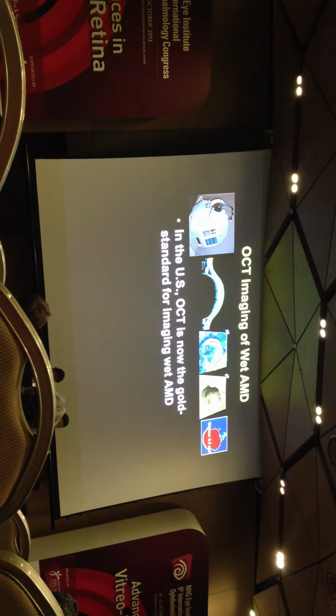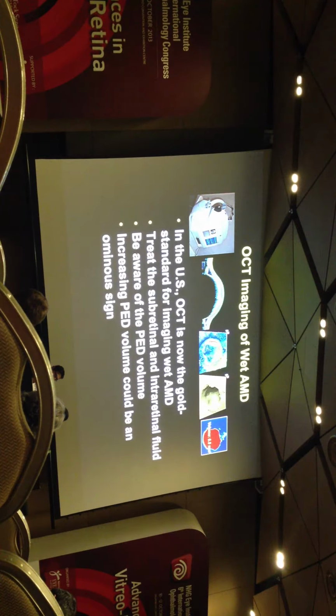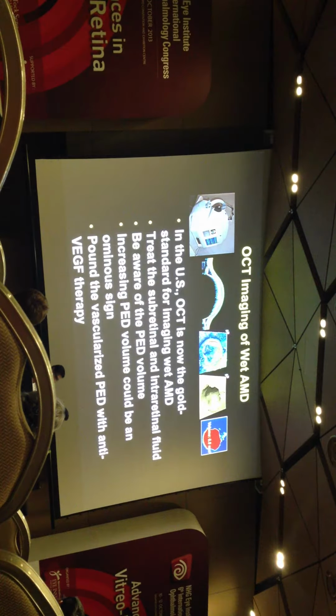So in the US, OCT is now the gold standard. Now it may not be outside the US with fluorescein and ICG multimodality imaging, but in the US, it's the gold standard. Treat the subretinal fluid and intraretinal fluid. Beware of the PED volume. Increasing PED volume is an ominous sign. And I say pound the vascularized PEDs until you get it as small as possible. Thank you.